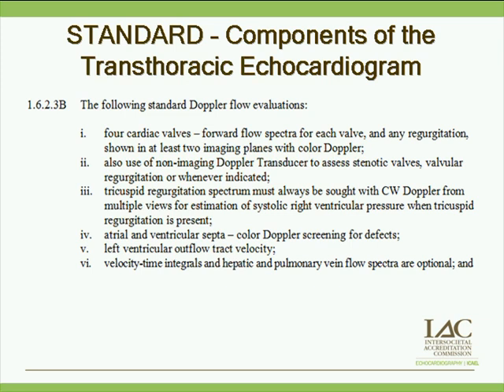The following Doppler evaluations: the 4 cardiac valves, forward flow for each valve, any regurgitation shown in at least 2 imaging planes with color Doppler. So make sure you do that. Make sure you turn your color on and get at least 2 views of any regurgitation. Also, the use of the non-imaging transducer to assess stenotic valve, valvular regurgitation whenever indicated, and that's again that PEDOF or dedicated CW probe, which we're going to talk a little bit more about in just a minute.